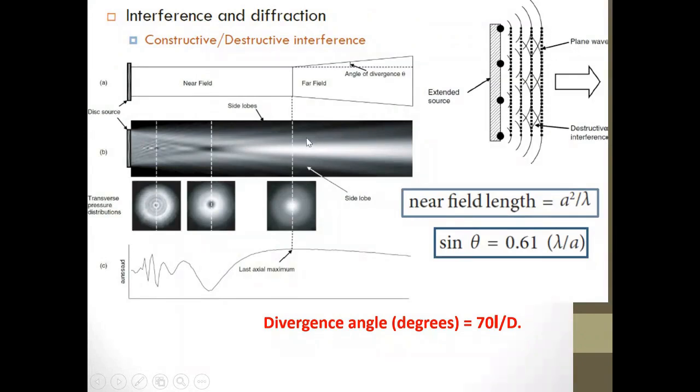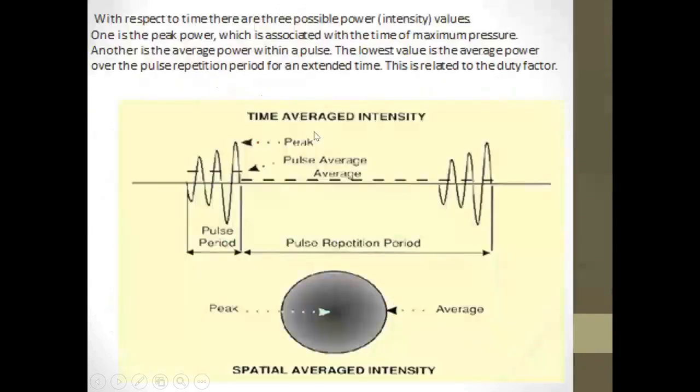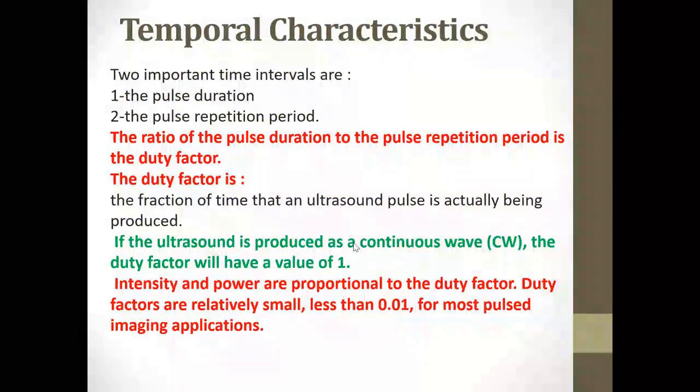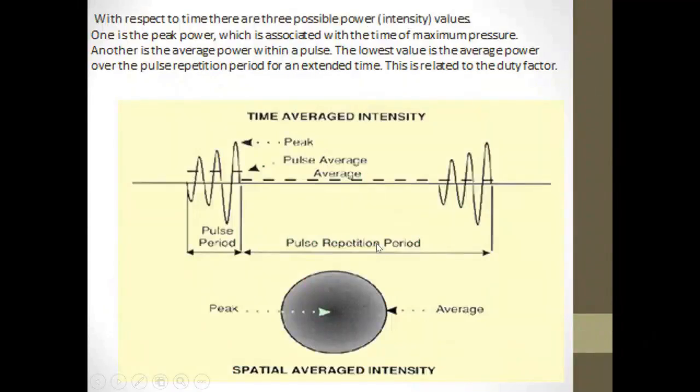We talked about the ultrasound concepts regarding pulse duration, pulse repetition period, and there is something called duty factor. The duty factor is the relationship between two things: pulse duration and pulse repetition period.